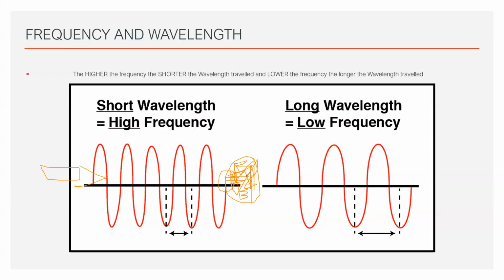But what it allows us to do is, because these sound waves with their energy will interact with the superficial tissue much better, they will give us good resolution. So if you wanted to look at the meninges or the outer layers of the brain, it would be highly recommended that you use a higher frequency. That would look at the superficial areas of the brain with good resolution. It would allow you to concentrate on those areas.